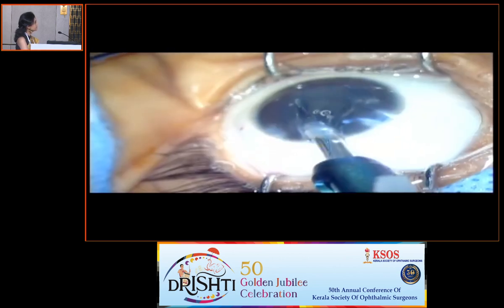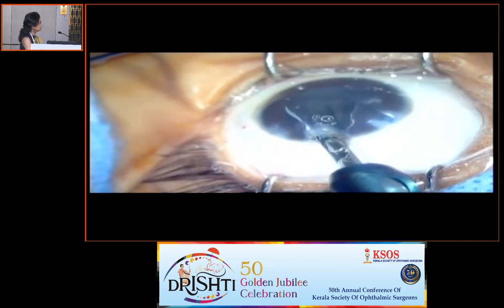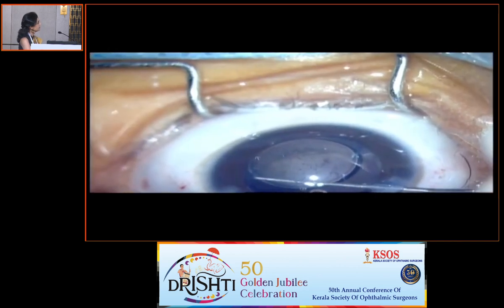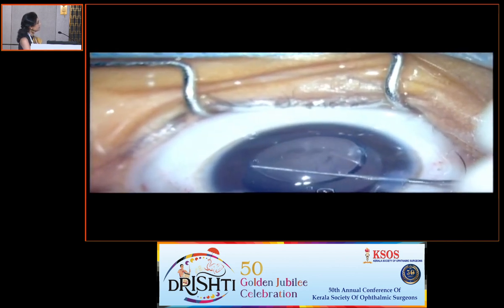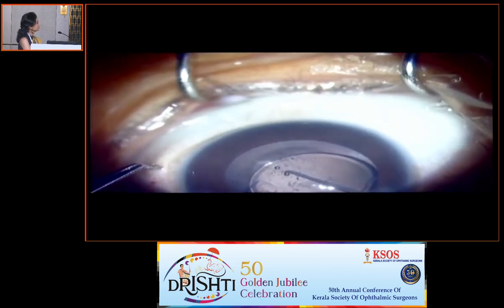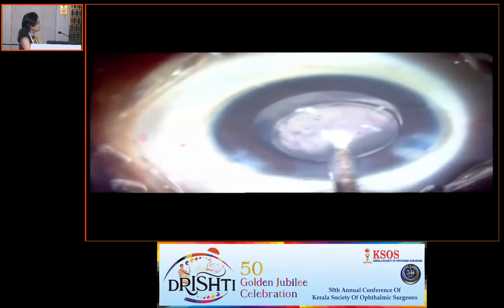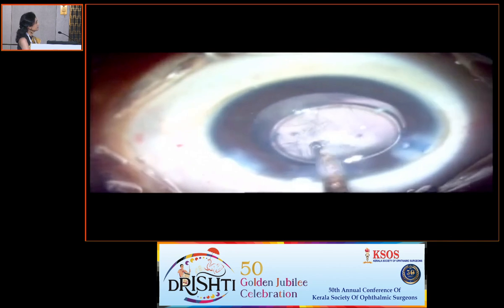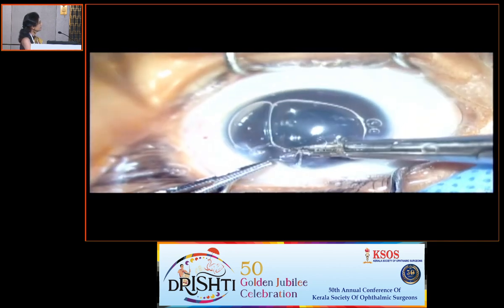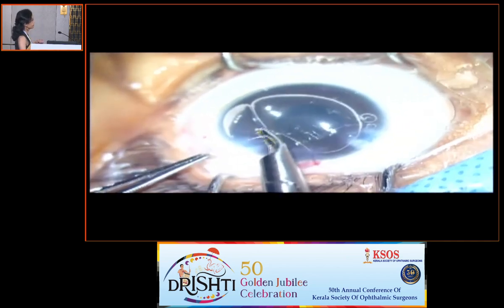the bag. And after doing a careful posterior capsulotomy as well as anterior vitrectomy, again a 3-piece intraocular lens is injected, it's dialed into the sulcus, and the optics are again captured in the anterior capsulorhexis margin, ensuring a good lens centration. So finally the viscoelastic is removed, and the eye is formed with saline and air bubble, and ports are secured.